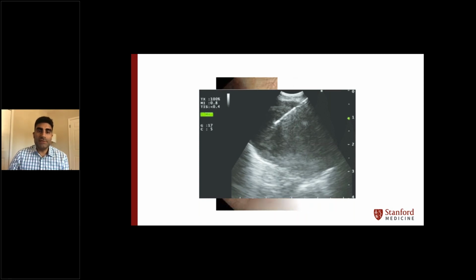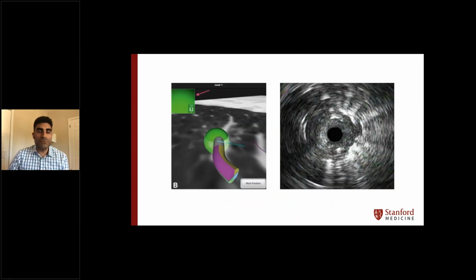And I think that peripheral lung nodule biopsies with bronchoscopy fall into a similar boat. On the left-hand side, we have electromagnetic navigation, which was a major breakthrough in our field and really improved our diagnostic yields from 15 to 20% up to 65, 70%, but really kind of plateaued there. And radial EBUS has been a very great tool for all of us, because it gives us some of the ground truth of what we're going after, which is trying to find a solid density.